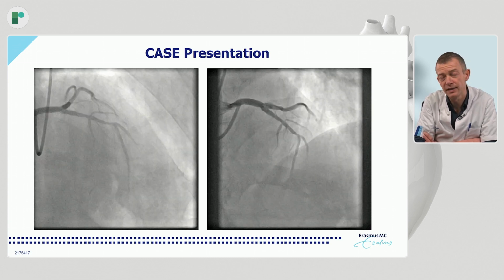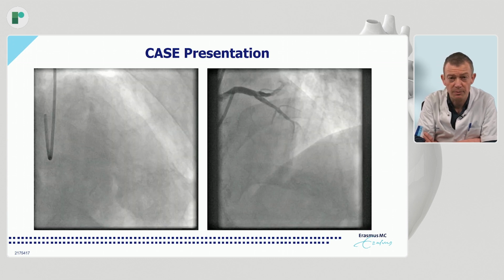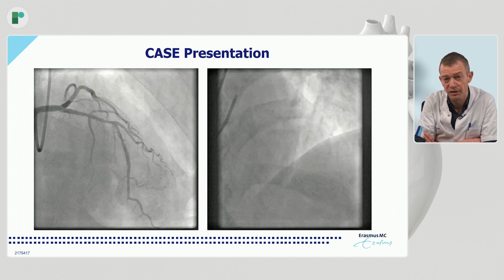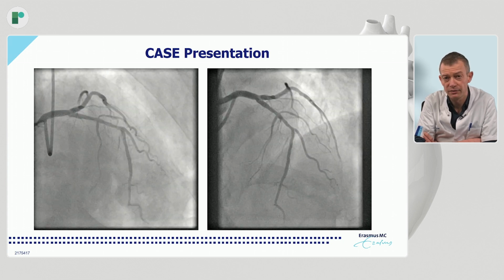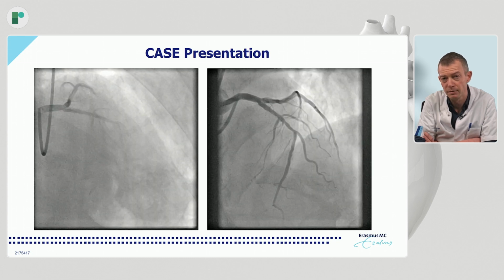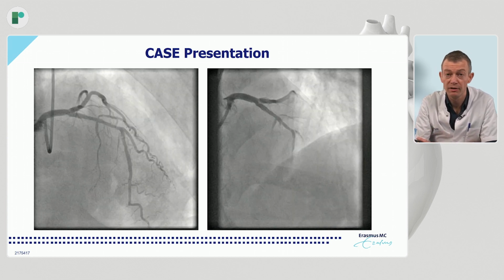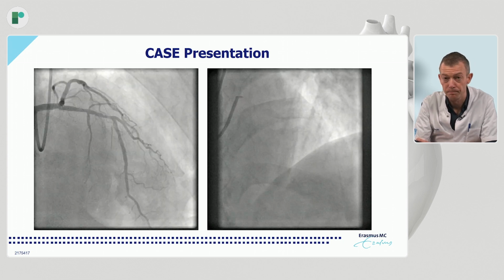Well, here obviously the fun started because we have this patient with some intermediate disease on the angio, on the CT scan, a borderline significant FFR in the mid to distal part of 0.78. So as in these days, at least here, we try at least to confirm these physiological findings and then get a little bit more of a flavor on the type of underlying disease that may drive you to proceed with a PCI or bypass, or proceed with optimal medical therapy.